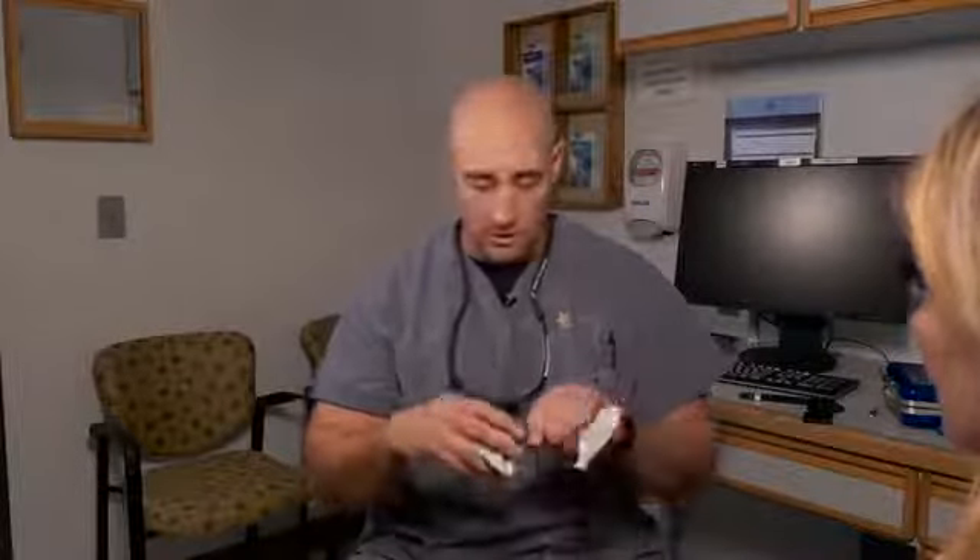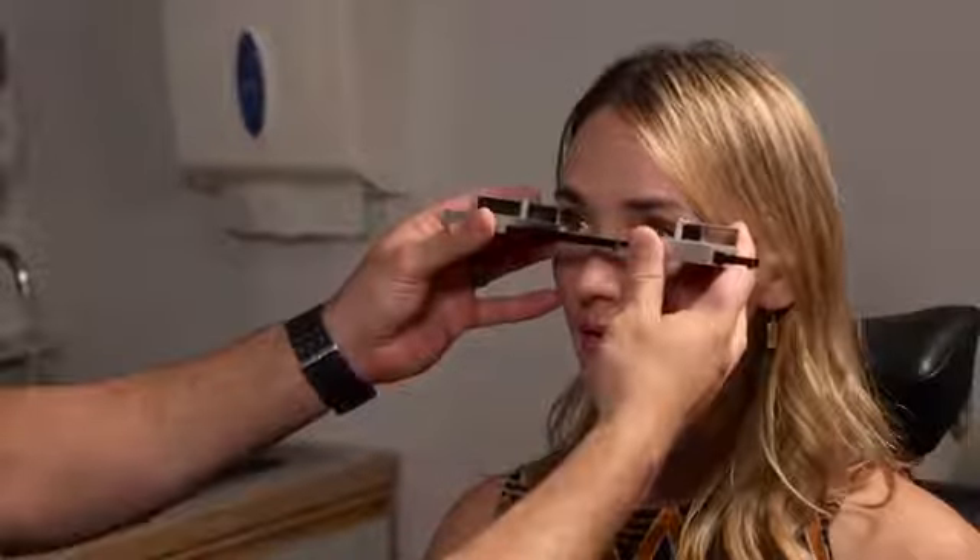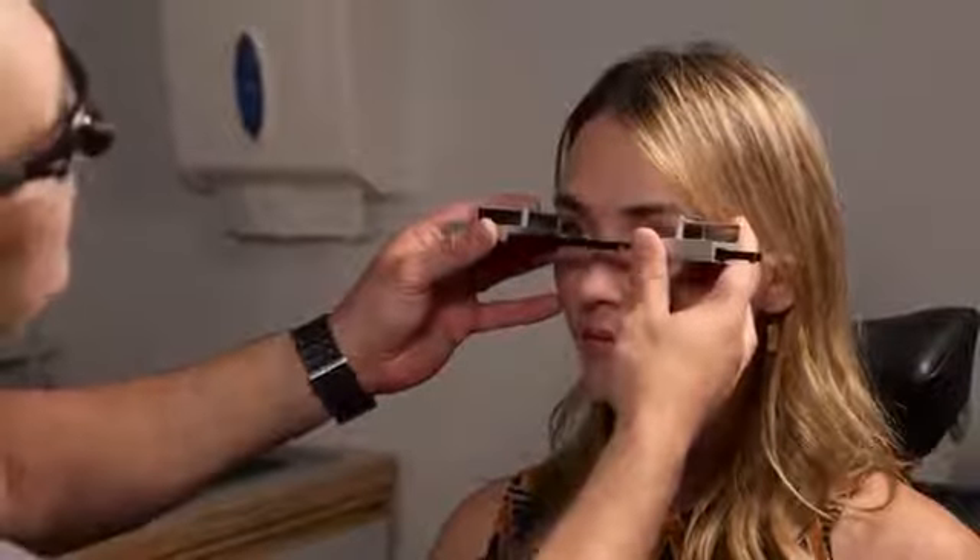Second, check for increased proptosis with a Valsalva maneuver. Set the exophthalmometer base back to where it was. Have the patient pinch their nose, lean forward, and blow as if trying to make their ears pop — you want their face to turn red, building up vascular pressure. Hold it up to 20 seconds if tolerated, then immediately check the exophthalmometer on the eye of concern. No increase in proptosis or change in measurement here — you're doing great.